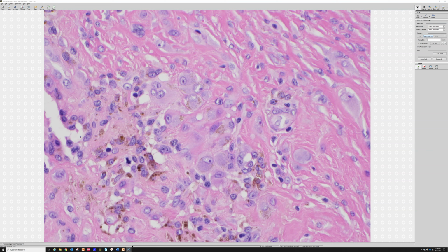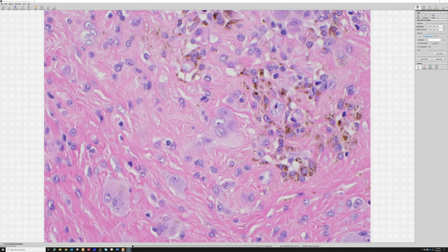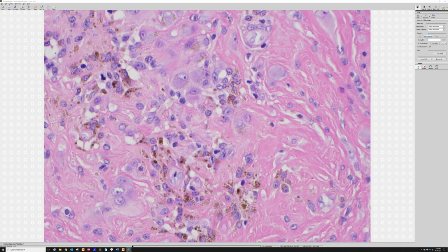Tenosynovial giant cell tumor at high power, they look identical. They have all the features we're talking about here. The difference is one of them is circumscribed and usually smaller, tends to be more in the distal extremities. And the other one tends to be more diffuse, infiltrative, often involves the synovial space of large joints like the knee, and tends to be more locally aggressive and problematic for the patient. Even though it's technically benign, it can really cause a lot of morbidity for the patient.